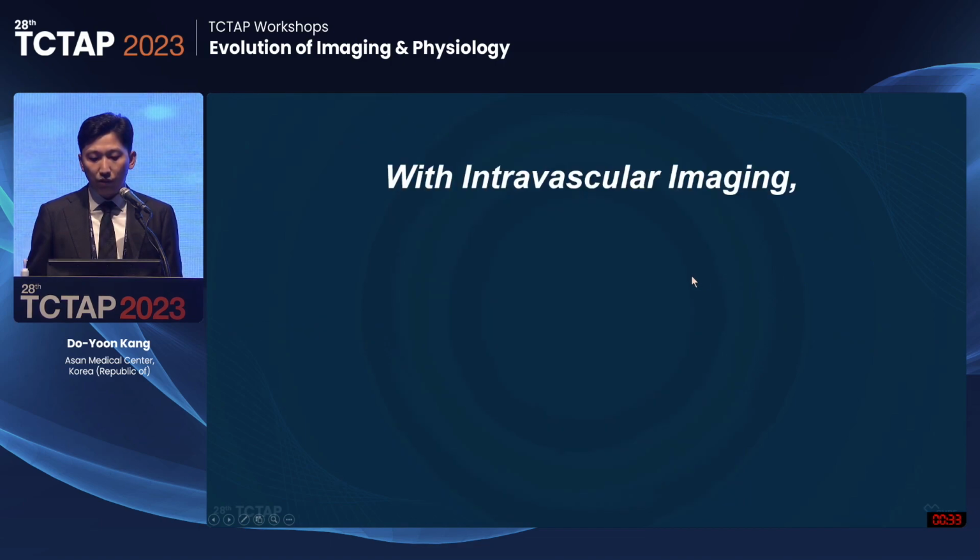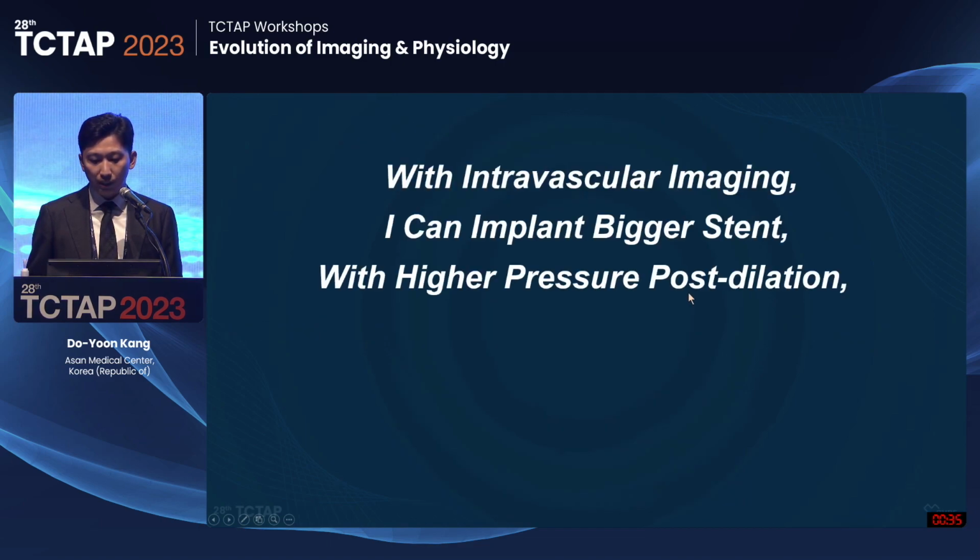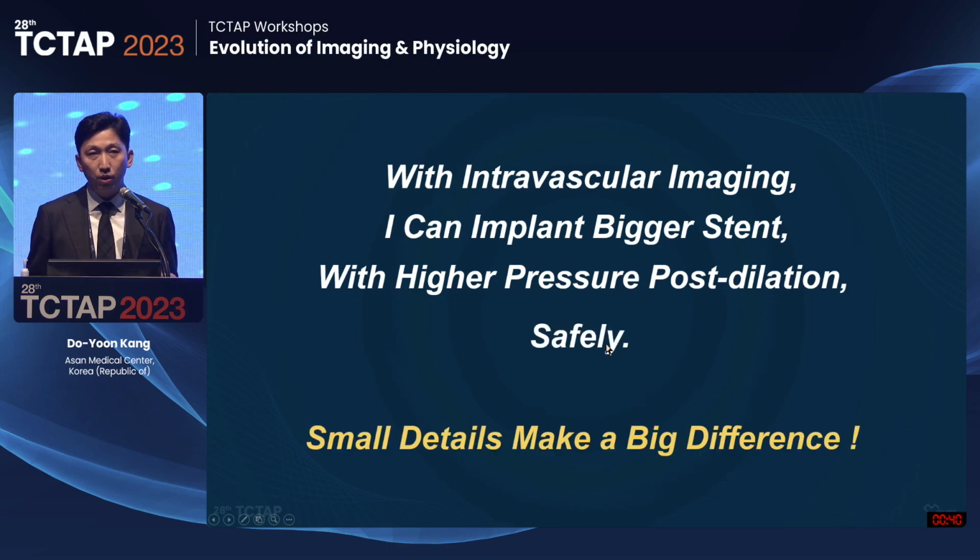Because with intravascular imaging, I can implant a bigger stent with higher-pressure post-dilation, so I get a bigger lumen area safely without complication. Those small details make a big difference in clinical outcome.